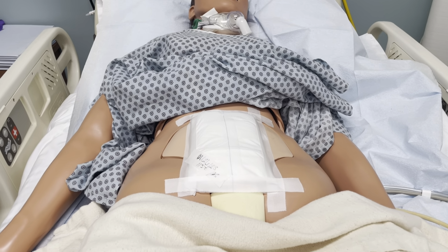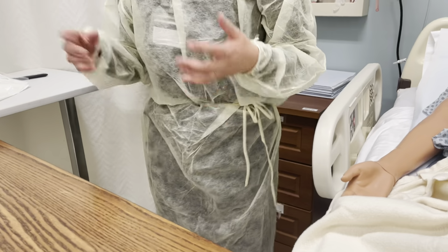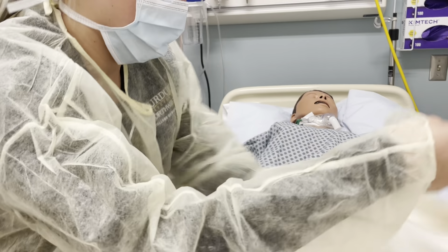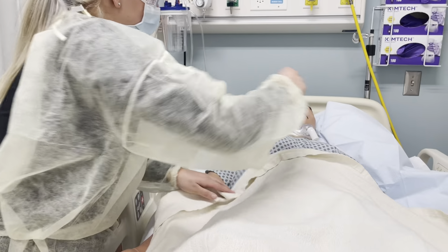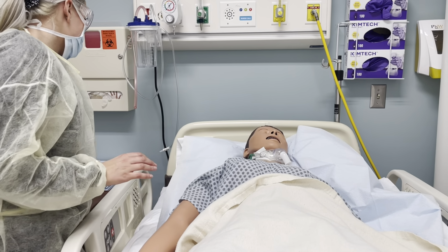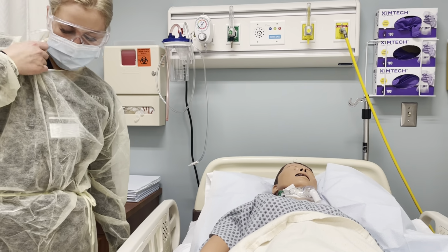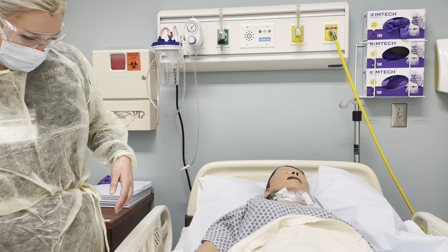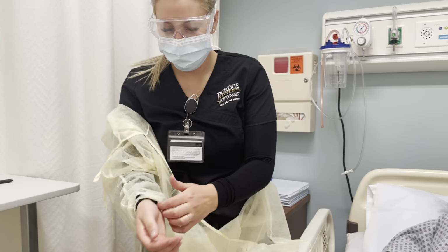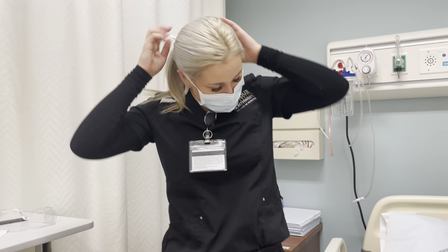Okay, and then I'm going to throw away my supplies. And then I'm going to cover the patient back up. Make sure that they are comfortable. How does it feel? Good, okay, I'm now going to lower the bed back down. Make sure the handrails are up. Okay, I'm going to remove my PPE. Throw that away. Remove my goggles. Remove my mask.